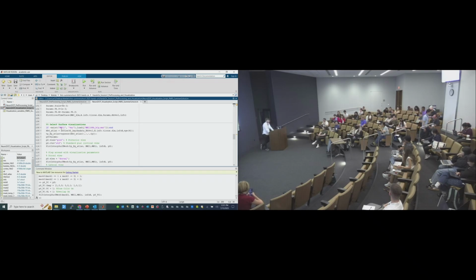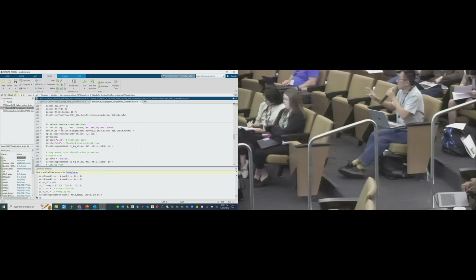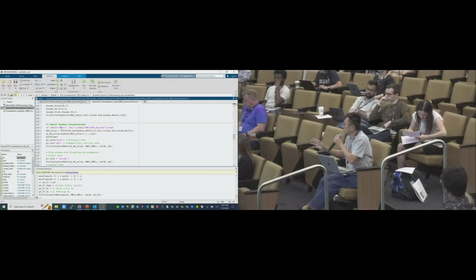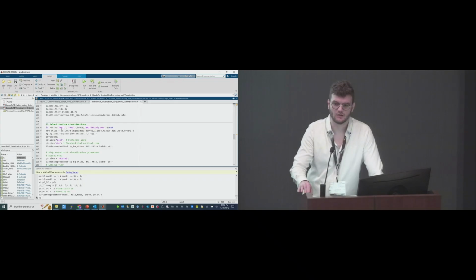Sorry, I'm still a little confused. Are you projecting the visualization of the activation map onto the standard MNI space? And where is the native-to-standard registration processing like this? So the question was about projecting from native participant space onto an MNI atlas. How does that work?